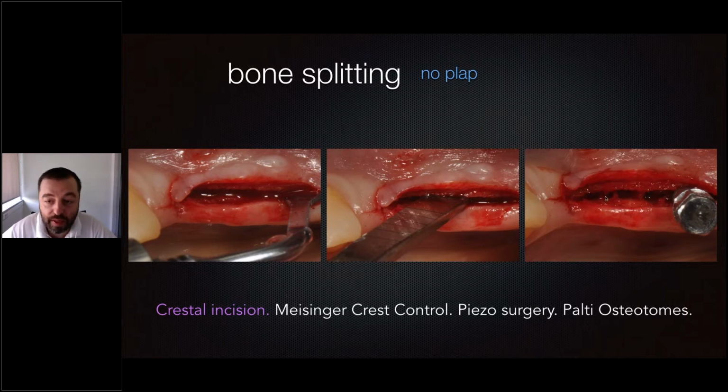The benefit for that is, even if there is a huge fracture here, everything will remain close to the periosteum, and basically there is no chance for losing these thin plates of the bone. The only problem is that when we have cortical directly to cortical, then it's a problem because we don't have enough blood supply, and we need to be very careful.